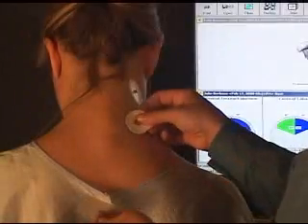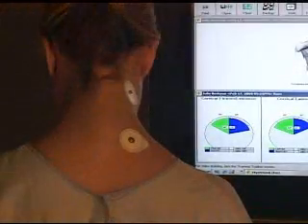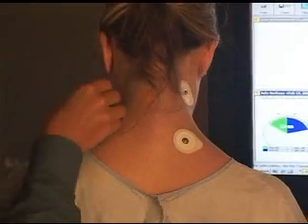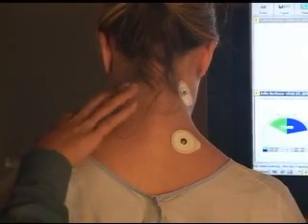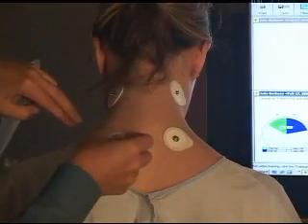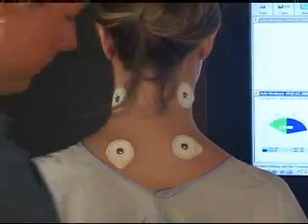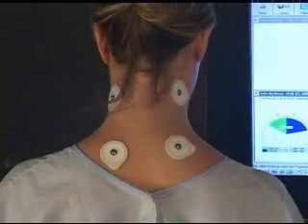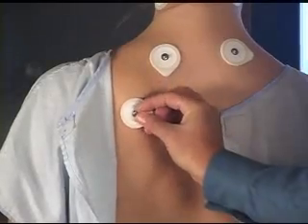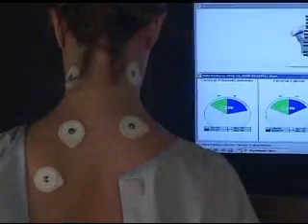Always go below T1. Go down to approximately T3, because you want to be able to get the muscle activity from the upper thoracic area, which responds. You can even put them lower than it shows here if you want to. Take them down to T3, T4, T5. And this is the left and right sides for the cervical paraspinal. This again corresponds to the upper channel 1 and channel 2. The left is white, red is right on the dynamic probe, and you also put the ground approximately in the bony prominence there. That's the black lead wire from the dynamic probe.